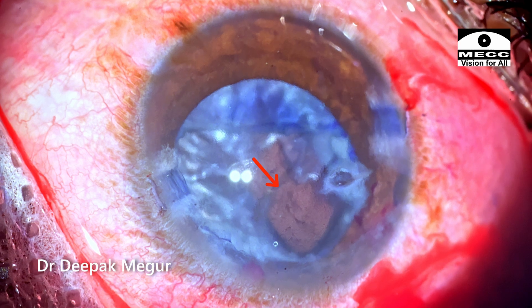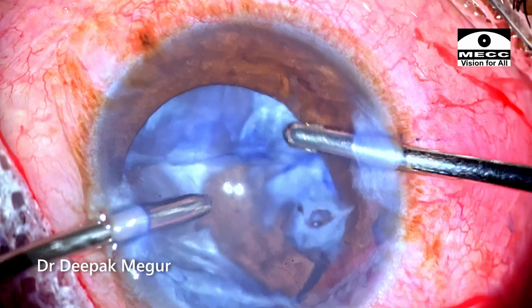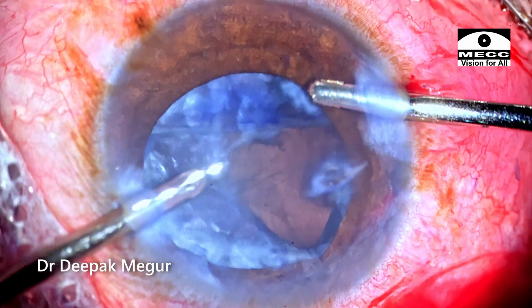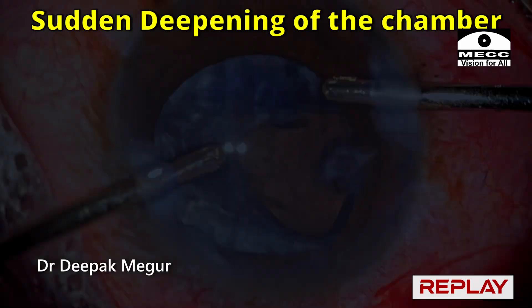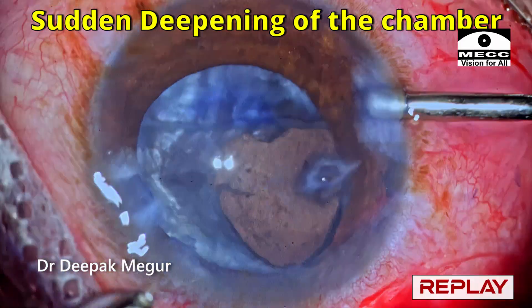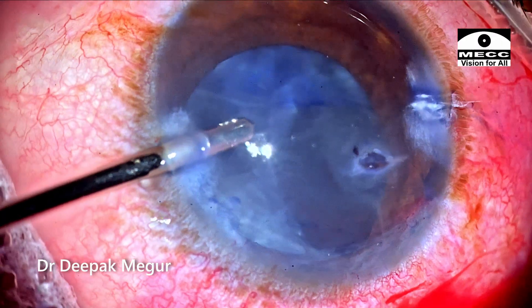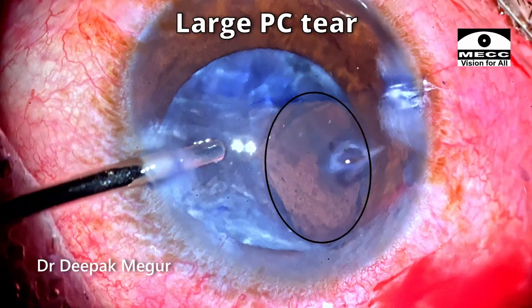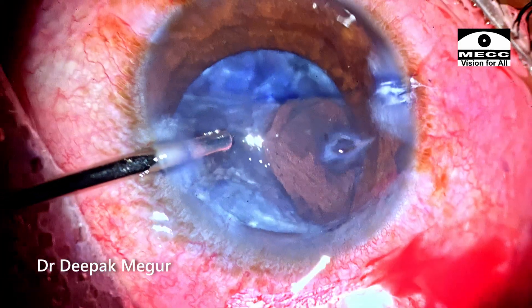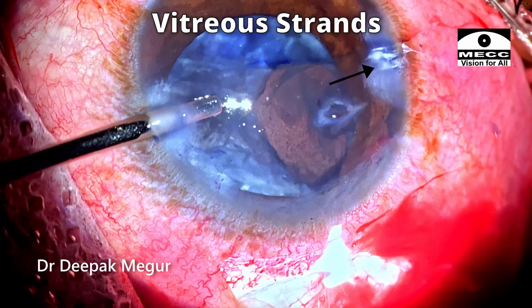This line behind the anterior capsule could be a posterior capsule tear. As I'm trying to aspirate out the remaining cortex, the underlying PC tear is confirmed. There's a sudden deepening of the chamber indicating a probable vitreous prolapse. Diluted triamcinolone acetonide is used to confirm the prolapse of the vitreous. This area with red glow is the area with the large PC tear. Vitreous strands are noted in both wounds — the main wound as well as the side port wound.